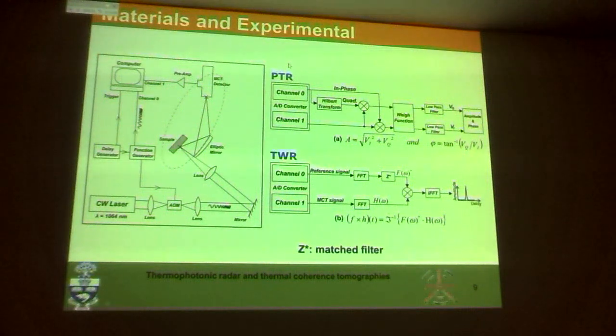So spectroscopy doesn't matter. All that matters is the black body source, the black body curve. And then you really look at the peak of the black body, which is about 7 or 8 microns for room temperature, but then you shift to shorter wavelengths as the temperature rises, and eventually you wind up with the visible and UV with the sun, which is 6,000 to 7,000 degrees. So obviously the black body moves into the visible. Most of the time you don't have to custom make these infrared detectors, but it's good to know what spectral response you're looking for. So that takes the signal and puts it into the correlator, and you get the response out. You get an amplitude and a phase out of this.